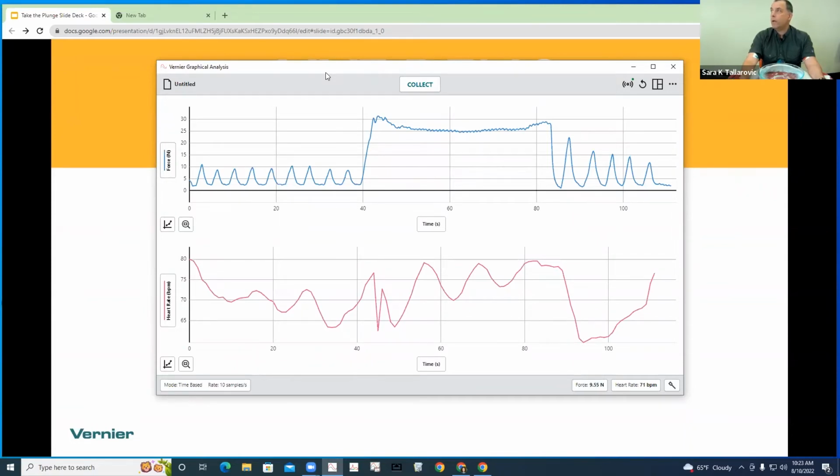No, but instead of EKG, you could use the heart rate sensor, for instance, either the heart rate monitor or the Go Wireless. Well, the Go Wireless wouldn't work with the original LabQuest, but the heart rate monitor would work because you really just need the heart rate. If you didn't have anything but EKG, you could certainly record an EKG trace, and then you just have to calculate heart rate from it. The advantage of having the GoDirect sensor is that it has a lot of extra channels built in for you, so it's a little bit easier to get that heart rate reading.